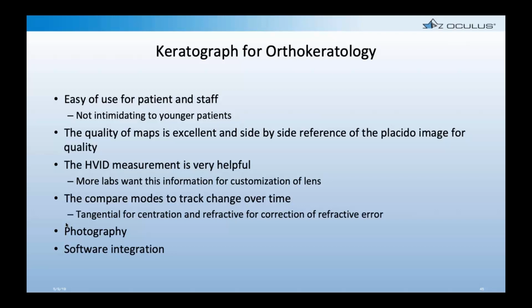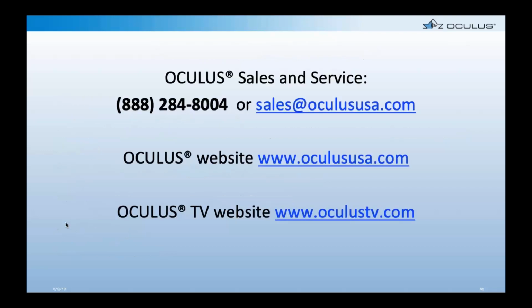Photography can also be nice too if you have patients who have maybe developed some corneal staining and you want to document it as you go through and manipulate your lens parameters to try to eliminate that problem. Having the ability to track those things over time is also quite nice, and the software integration is there as well.